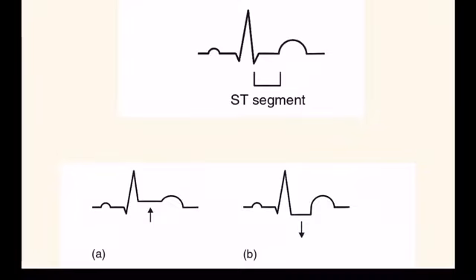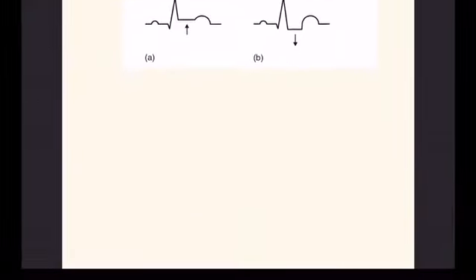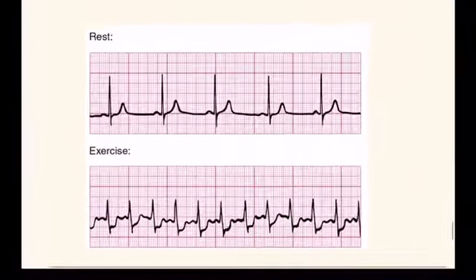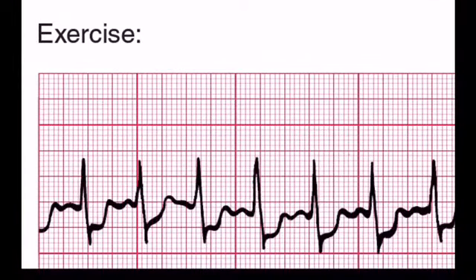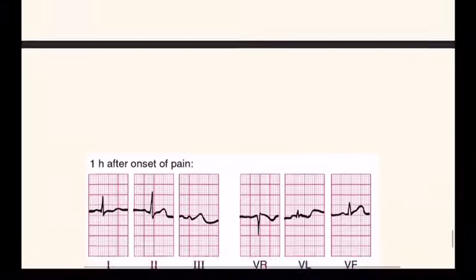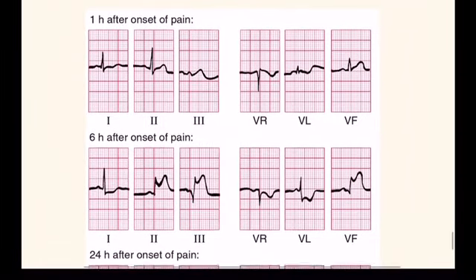Okay, now suppose I take an ECG from a person. First see this ECG, guys. This is showing the depression of the ST segment while the person exercises. So this can be present, and this can be normal. Okay, now see this, guys.